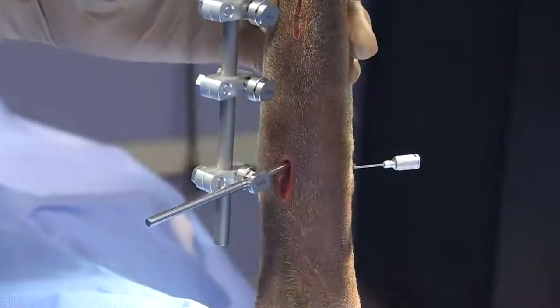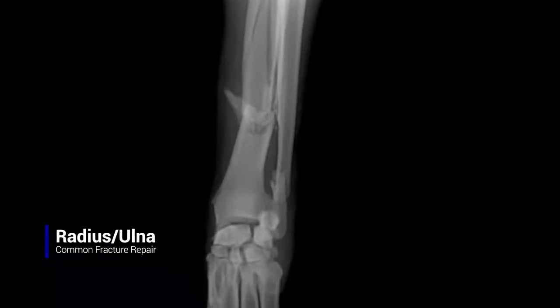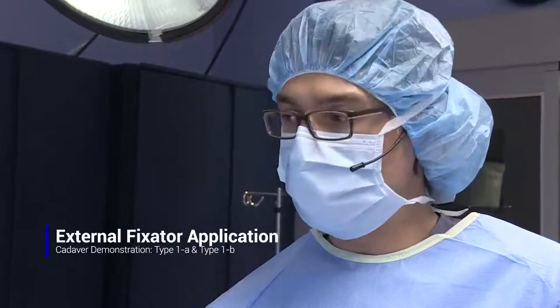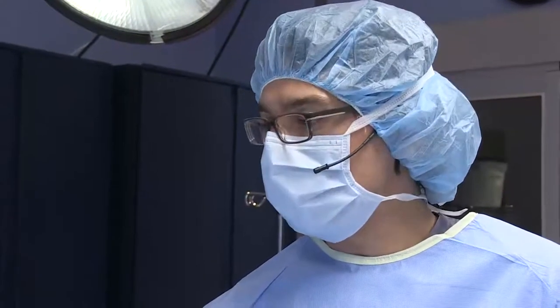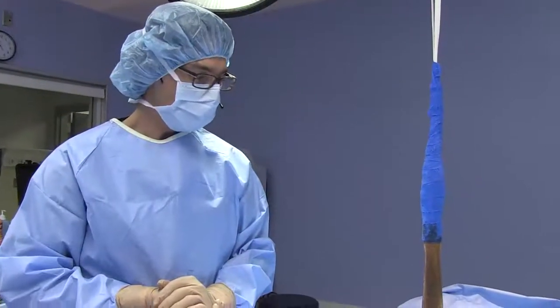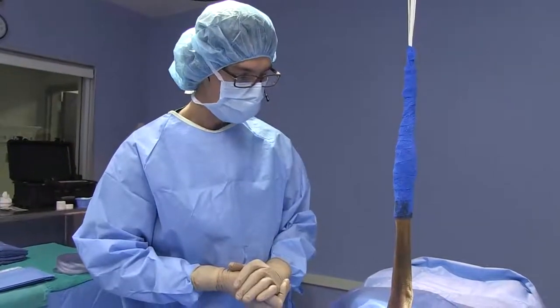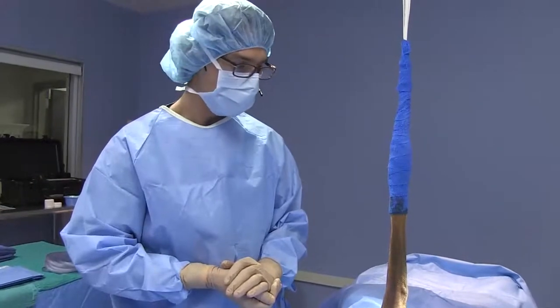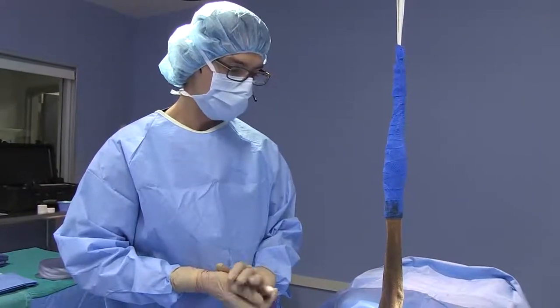What we'd like to share today is a demonstration of applying a linear external fixator apparatus onto one of the most common fractures we see in veterinary medicine: a radio-ulnar fracture. We're going to specifically demonstrate a type 1a construct and then add an additional plane to make it a type 1b construct. The goal is to show the logistics of putting this together and highlight specific things to keep in mind as you're placing these in your own clinic.